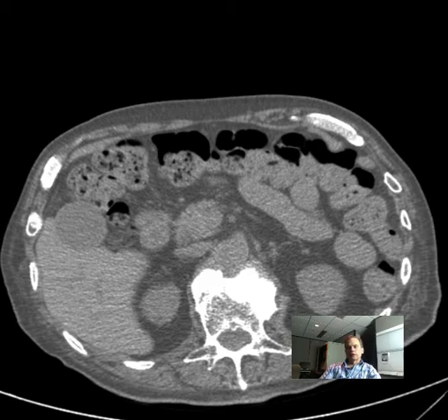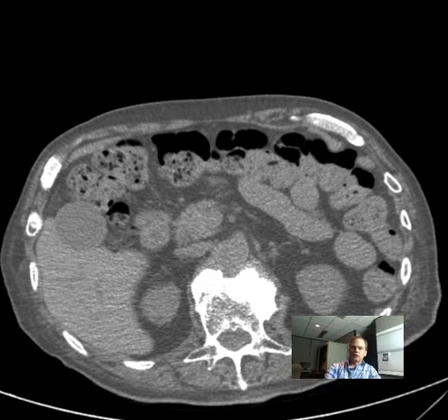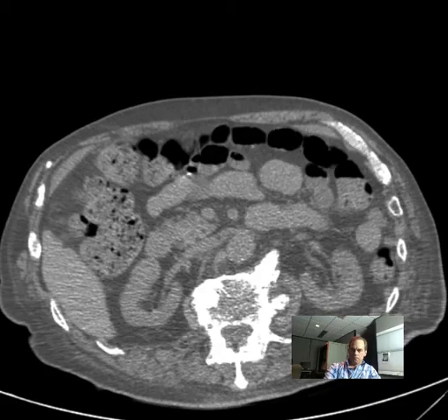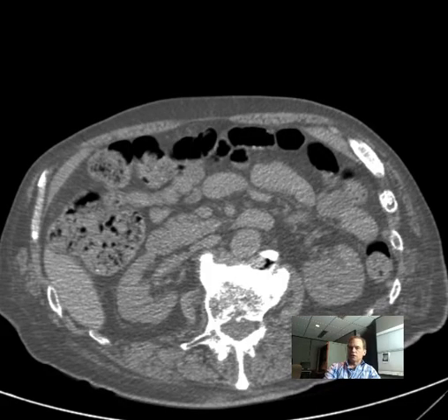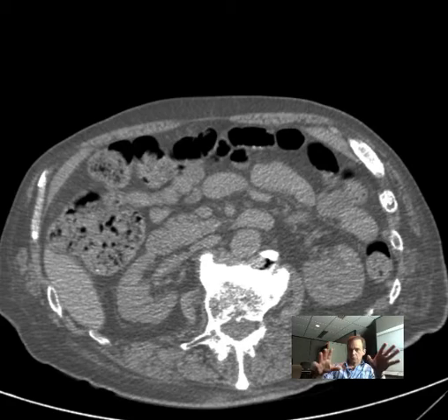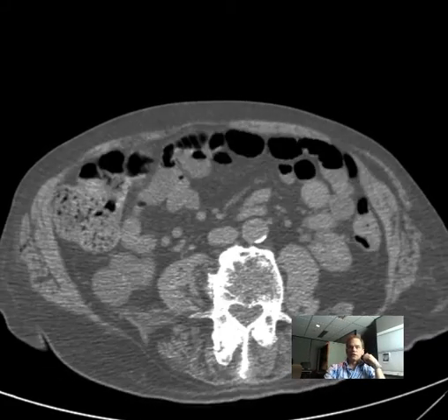Hey there guys and gals, I'm going to go over some cross-sectional anatomy of the abdomen. We have some CT scans, and rather than spend a lot of time on each case, I'm going to go from one case to another so you see more examples of the same basic things. Here we have an unenhanced CT abdomen.